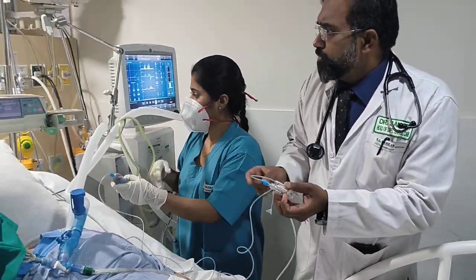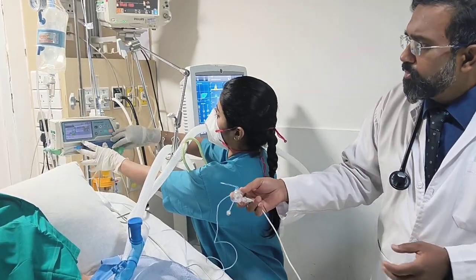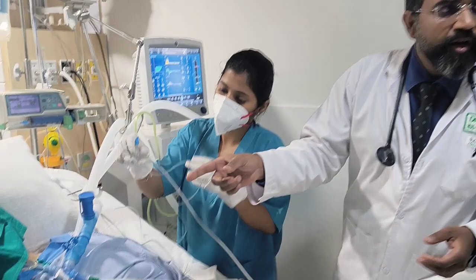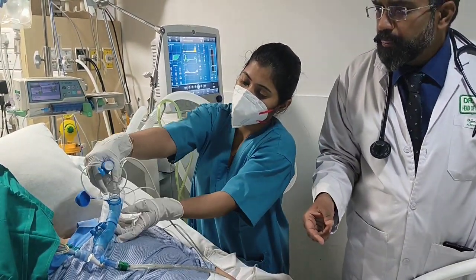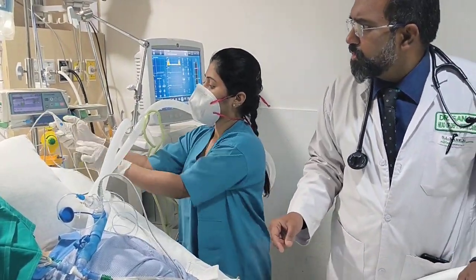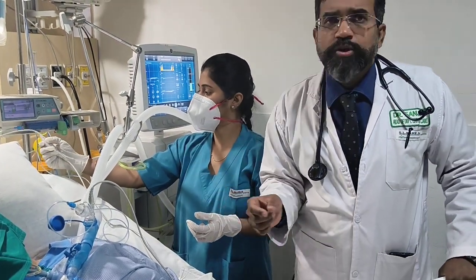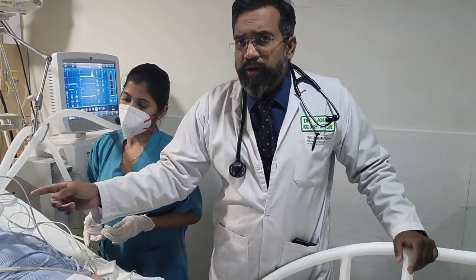You attach this to the infusion pump, and at the same time, you attach this to the inspiratory limb of the circuit, and you switch on the controller at 6 hours. Okay, and that's how we go ahead. This is the principle of continuous nebulization.